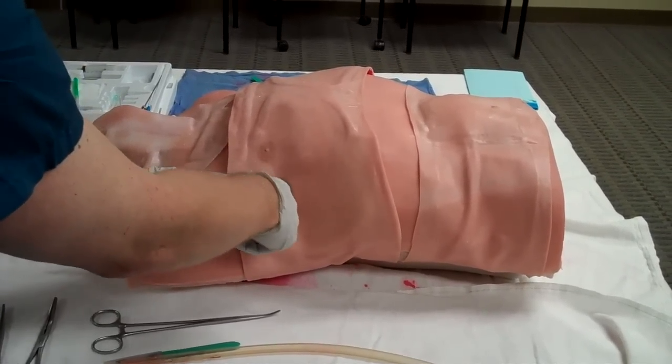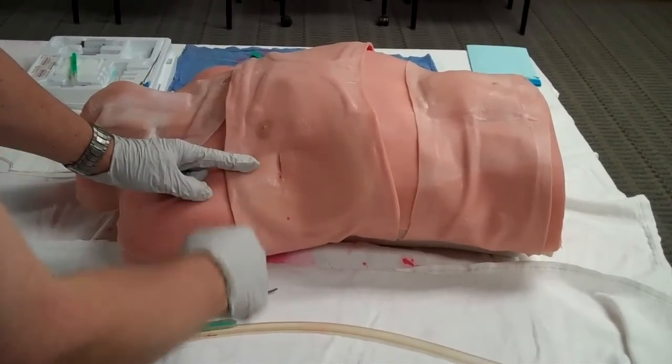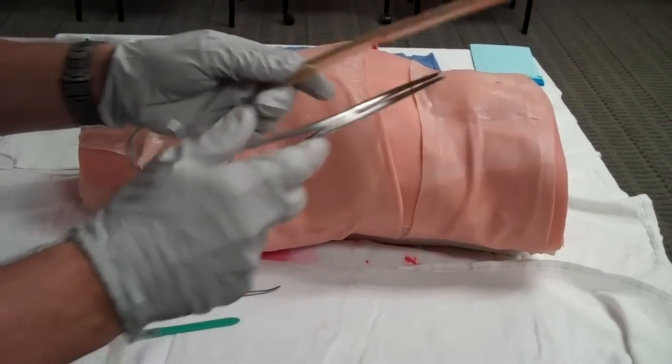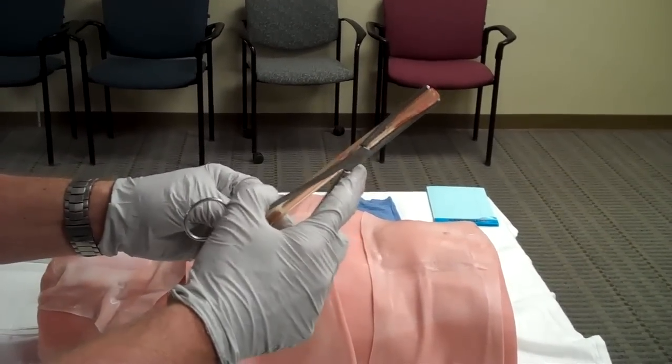Once you've made sure that the lung is freed from that area, you can pull your finger back out, and now it's time to load your chest tube. My preference is to actually load it so that it's on the back of this clamp.